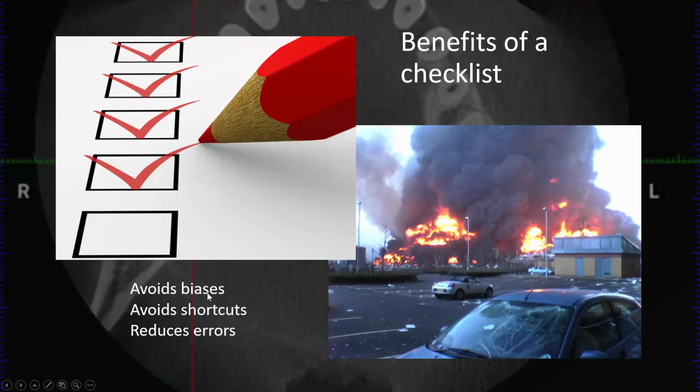And then the last one is the neck. And I include the TMJs in that because there's typically not as much to report on, although, as I mentioned, arterial calcifications, you'll see that in the neck.